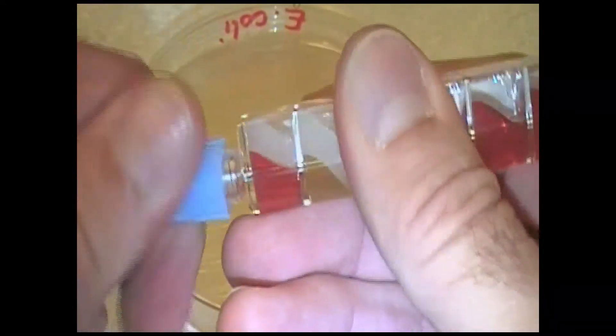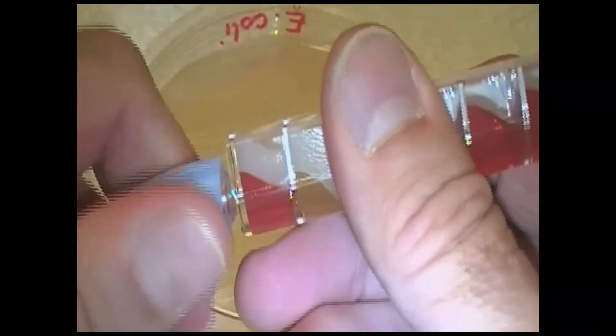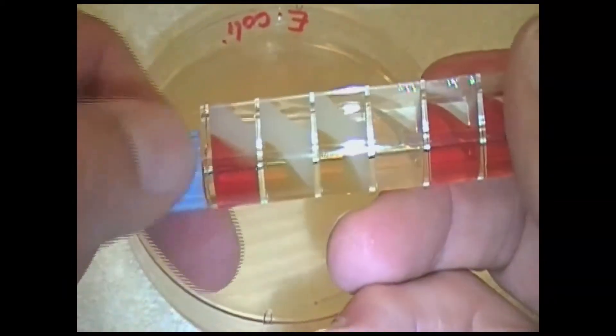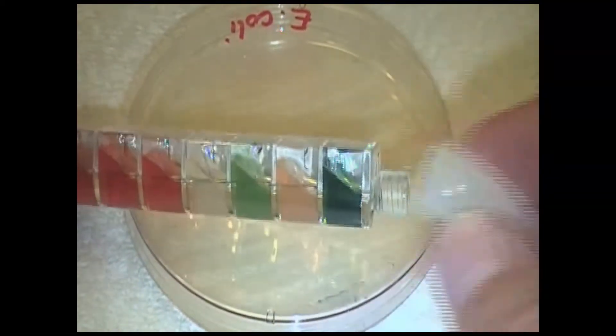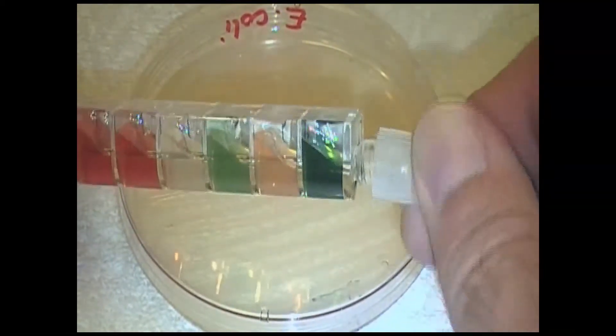at that point you come back and you put the blue closure on this end, and remember the blue closure always goes near the wax layer. Then we're going to take the white closure, and we're going to put the white closure on the other end.